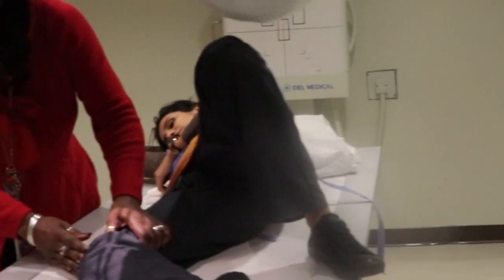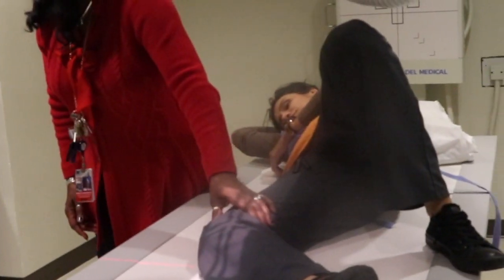Rotate your heel down. Relax your leg. Many times when they relax the leg, the patella is not perpendicular and the heel's down against the table. We'll have to roll into the table and bring that heel up to get the leg in a true perpendicular and lateral position. So always feel for the patella.